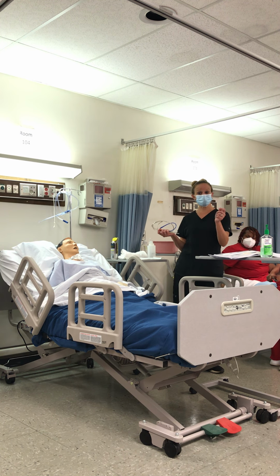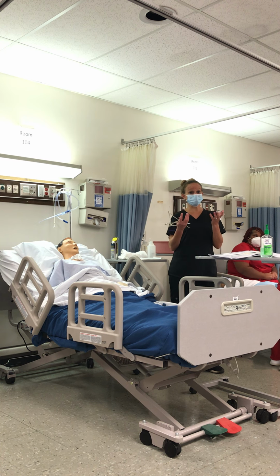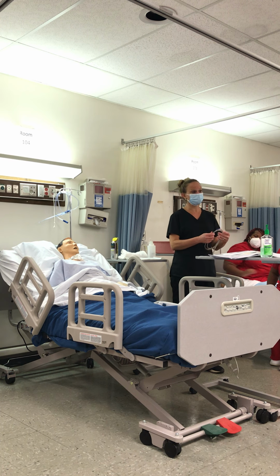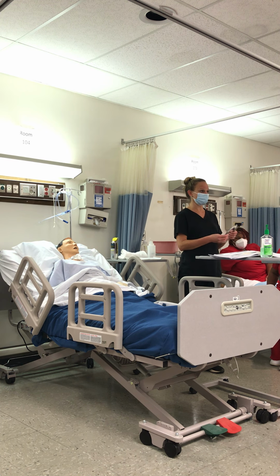When you need gloves on is when you're inserting the tube, when you're going to be coming in contact with their fluids. Would it be better to have gloves on because I could have things on my hand even though I clean them? Yes, it'd probably be better to have them on. Even when I'm drawing up injections that are going into certain areas, especially like a joint, something you want to really be clean, I put gloves on to draw that up, even though I wash my hands.